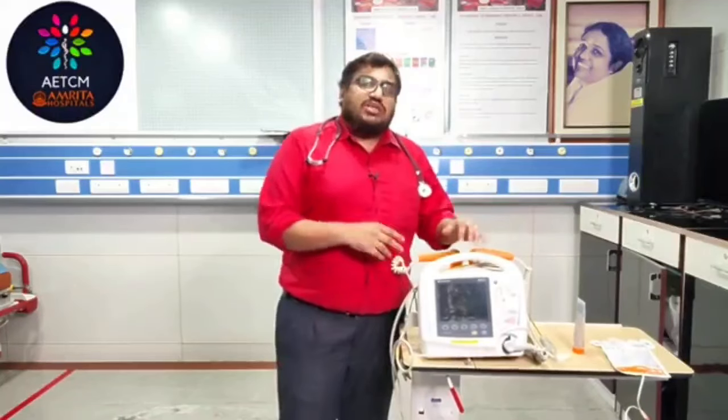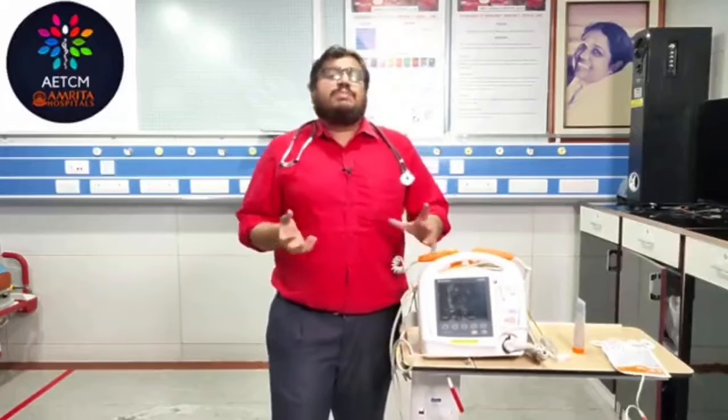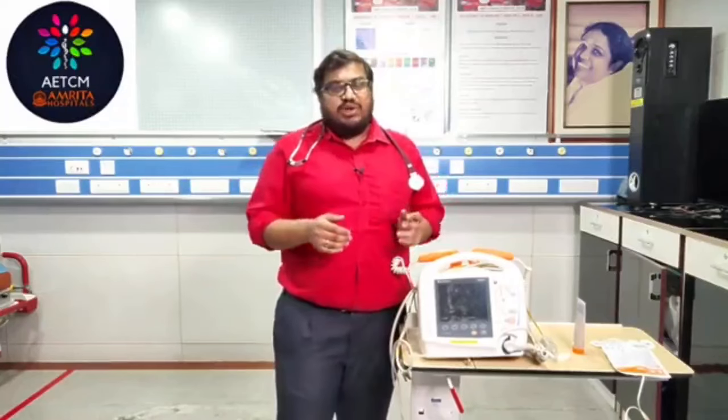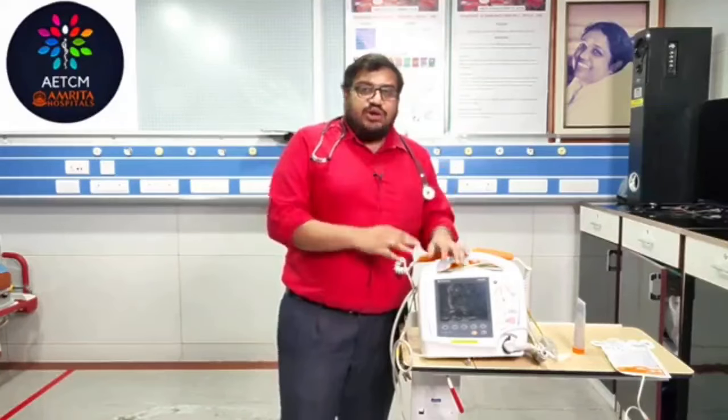There is something else called an automated external defibrillator, or AED. We will show that in a separate video. An AED doesn't need any medical knowledge. You just attach the pads, and the machine itself will recognize the rhythm and tell you what to do in a case of cardiac arrest. Maybe in our BLS video we have shown the AED, so you will understand its use. So that is regarding the defibrillator.